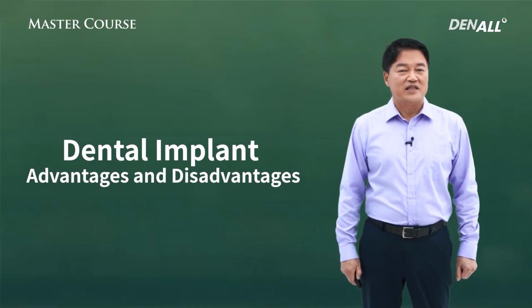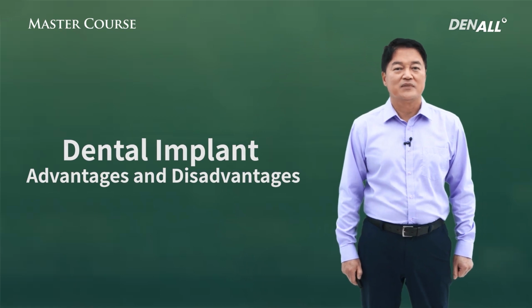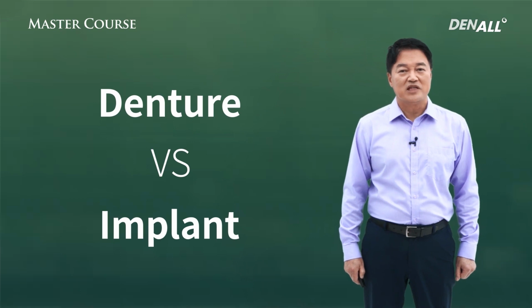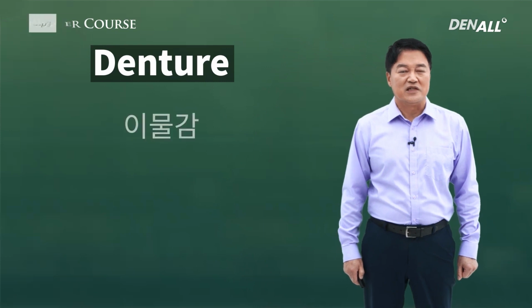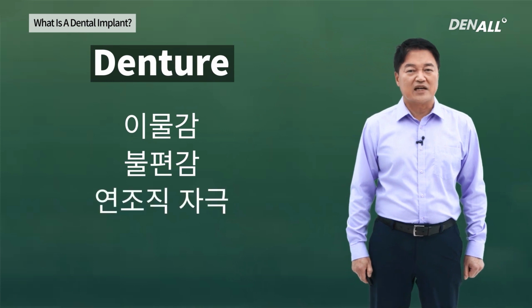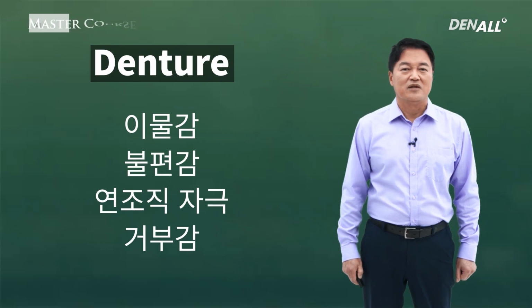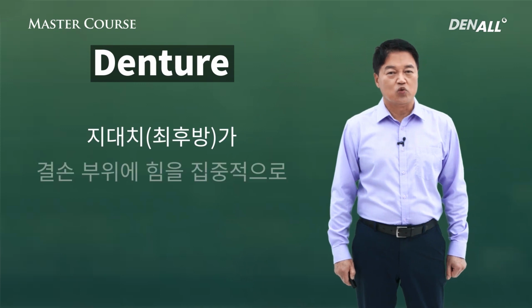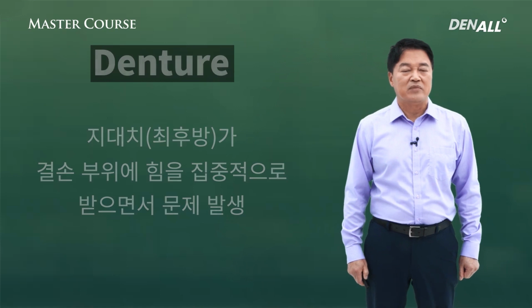Let's look at the pros and cons of implant treatment in detail. First, compared with dentures, what advantages do implants have? As you know, with dentures, there's irritation, discomfort is very significant, it stimulates the soft tissue, and people have resistance towards dentures. Another problem is that the most distal abutment receives most of the load from the missing area, and it can lead to problems.